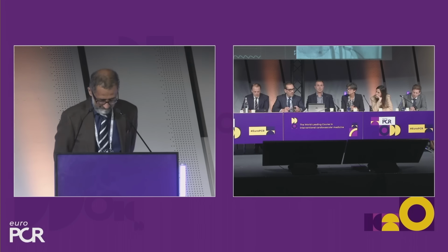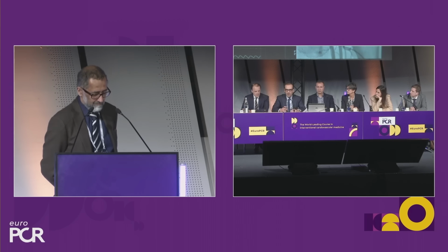In other words, using a balloon sized according to the mean diameter of the annulus. Is it what you do also, Joël, for example? More and more. So one or two years ago, I started with minimum diameter, but then to optimize the stent frame expansion, I am going a little bit higher in diameter, according to the mean diameter, or between the minimum and the mean. Yeah.